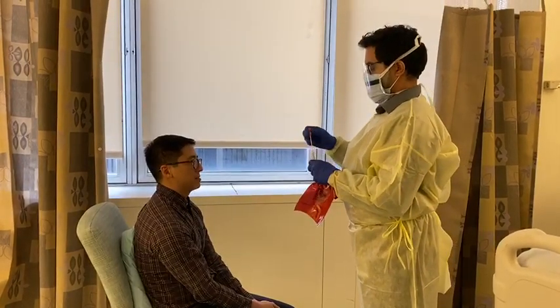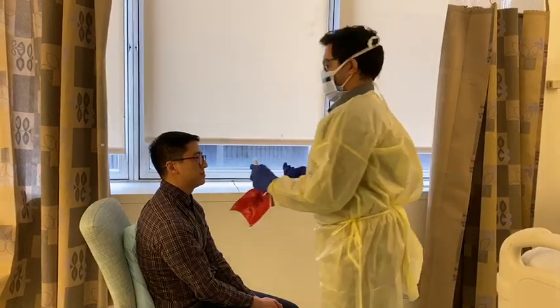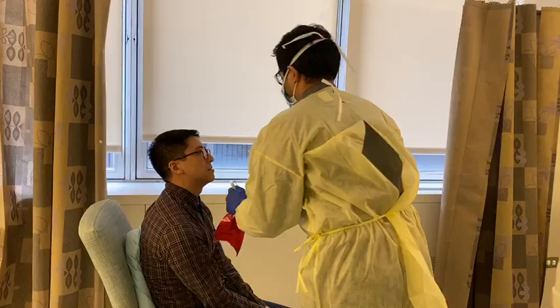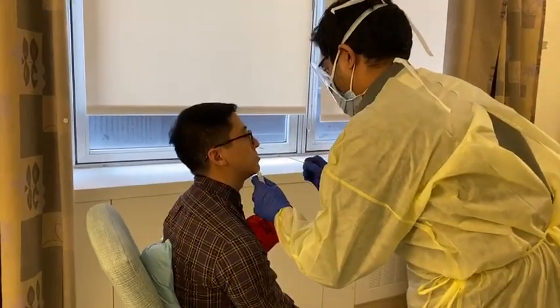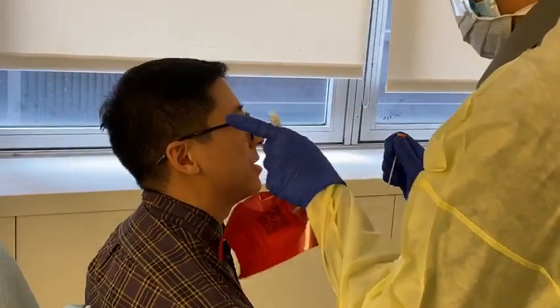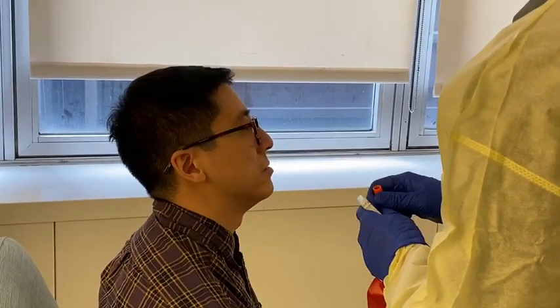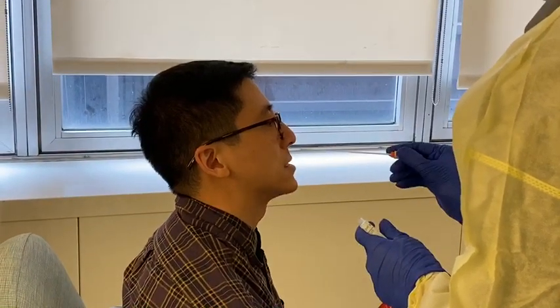Now he's going to tilt my head back just a little, and then he's going to put the swab in straight back, all the way — roughly halfway between my nose and my earlobe — and turn a couple of times to make sure he gets a good specimen.